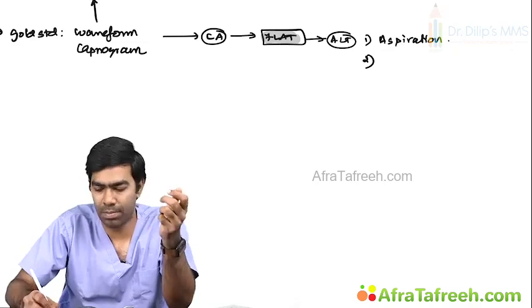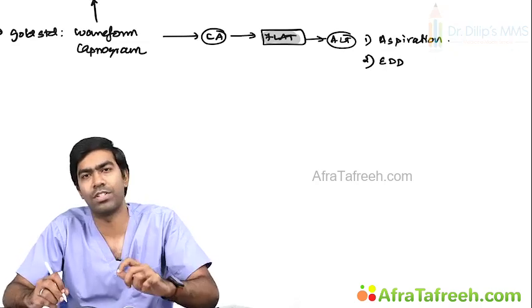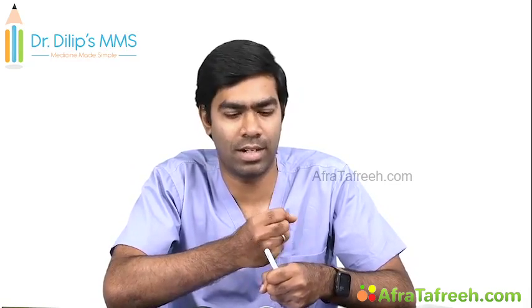So that's one way. Second, a similar principle can be applied in certain devices called esophageal detector devices. Again, they work by a similar principle. You have a balloon-like device, you compress it. It's like a small balloon-like Ambu-like structure, a self-recoiling structure. So you compress it and you put it in the tracheal line. When you release the balloon, if it's in the trachea, definitely it will re-expand very fast because the air is going to fill into the balloon.